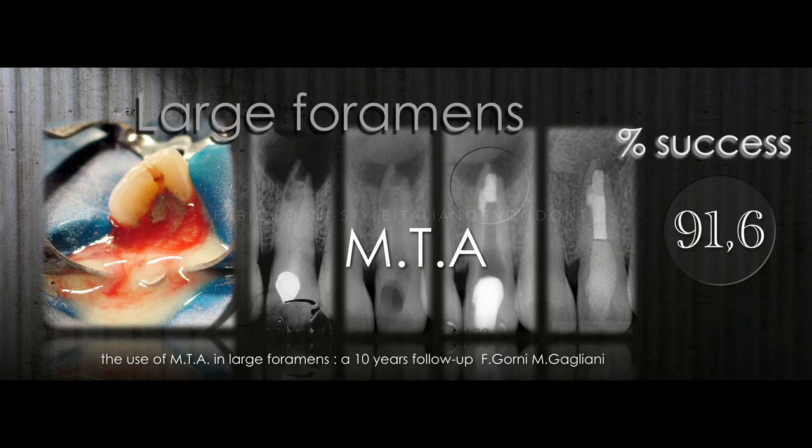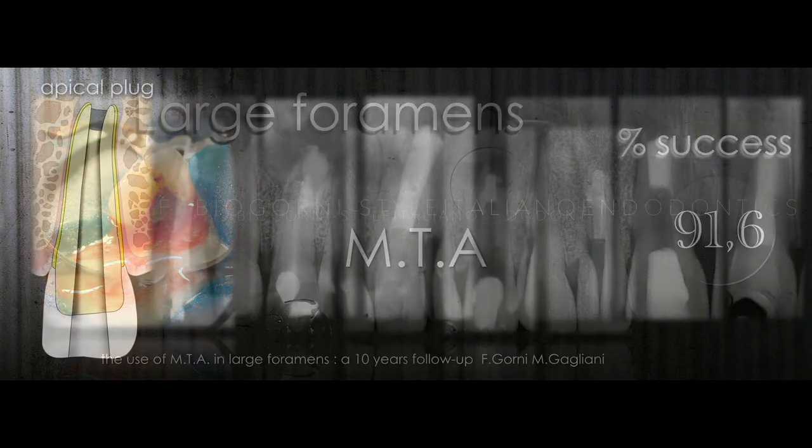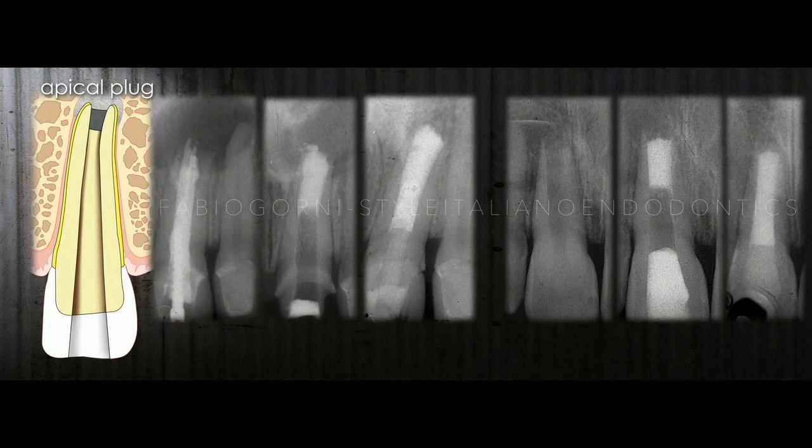We have to clean, shape, and pack the area, only now we work in the apical third of the roots. As you can see, the success rate is very high. Here are a couple of examples of large foramens, and as you can follow, the post-op shows a perfect healing, even in a huge lesion, like in the central incisor on your left.